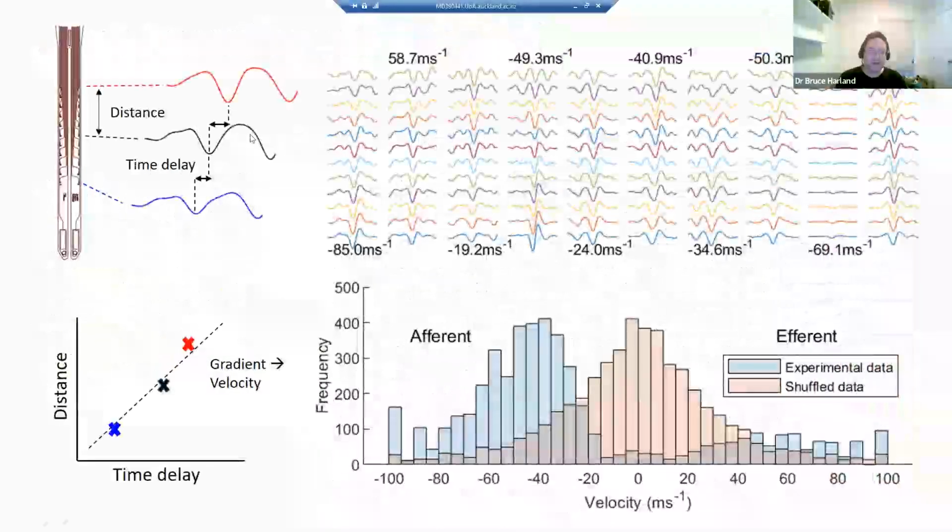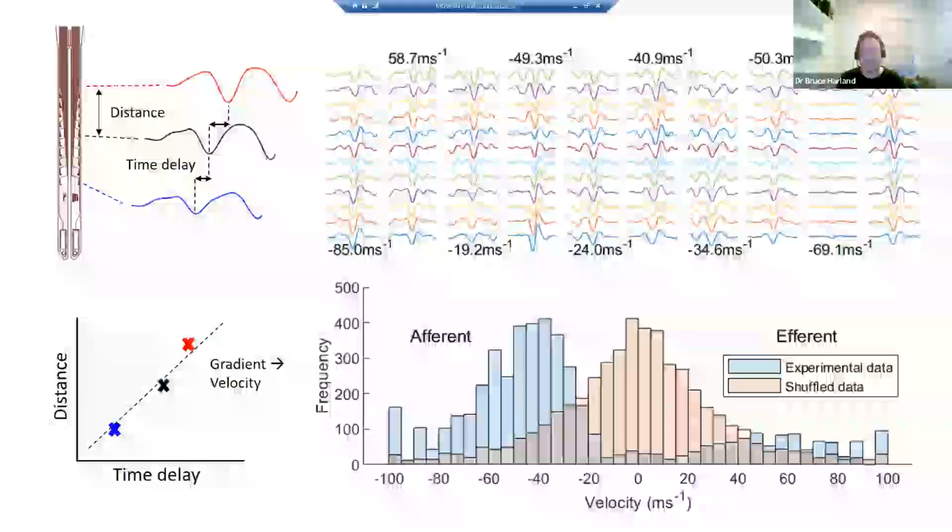So Brittany had an investigation and look at these, and what she found was that on each electrode, these signals are slightly offset from each other in time. And the reason is because this is the same signal that's being recorded as it propagates down the spinal cord. Because we have rows of electrodes over about 1 centimeter, the difference in the signal between electrodes shows the time that it took to reach that electrode, if that makes sense.